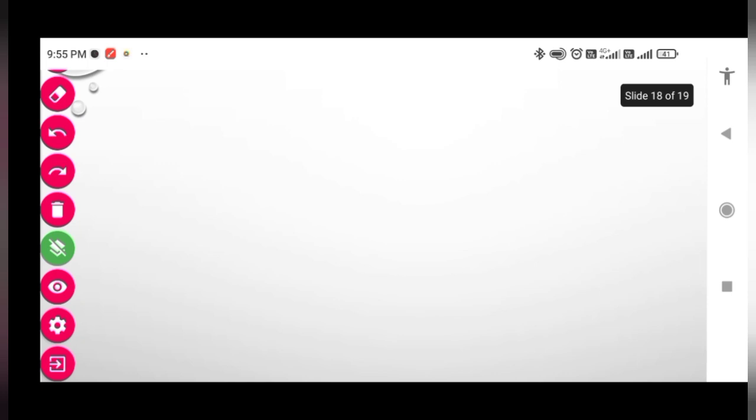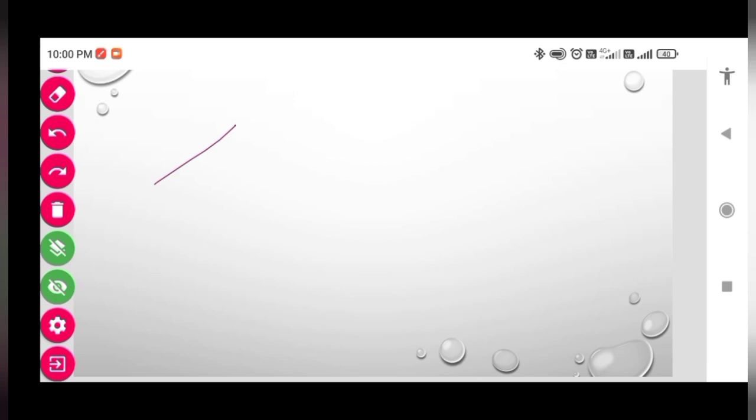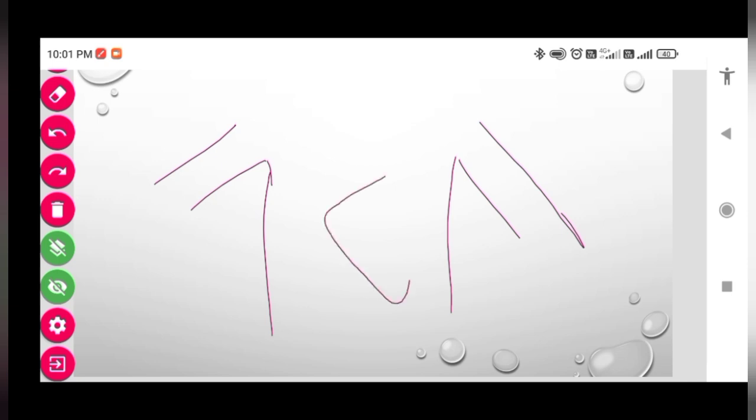Let me explain. So coming to the heart, if you take this as a man, the heart is situated slightly towards the left side of the chest, and its axis will be something like this.